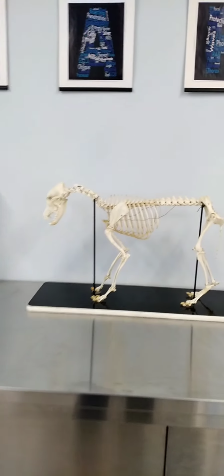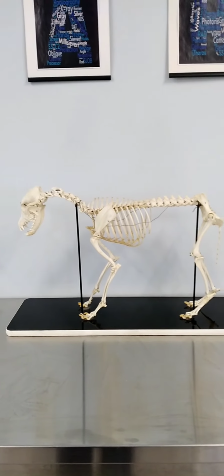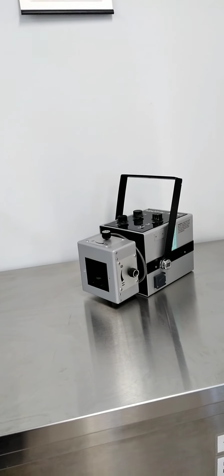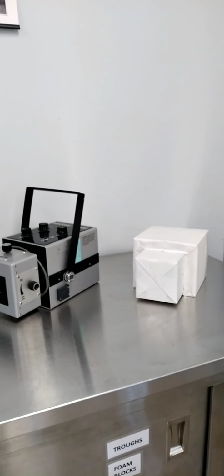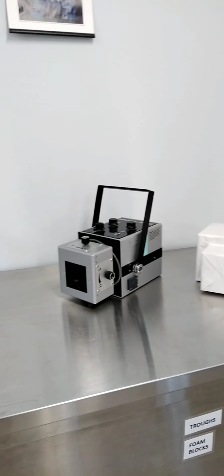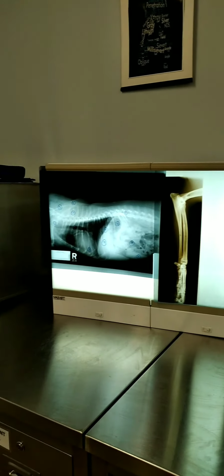We have the one dog that we never fed, Skelly. I use him a lot to kind of point out principles of radiography, and it helps in terms of positioning as well. We have a really old paperweight, which is an old portable x-ray unit. It doesn't work anymore. And a bit of a lighter model that I made for 312. Again, this is 312 stuff, working with equine positioning and portable units. And then keeping going on this side, another double viewer with some pictures hanging up.